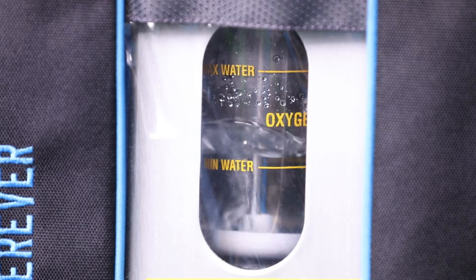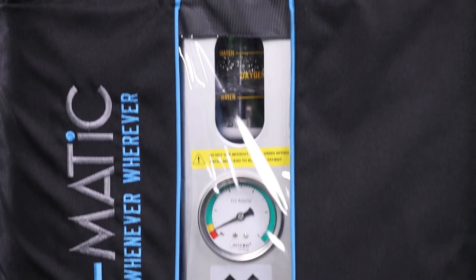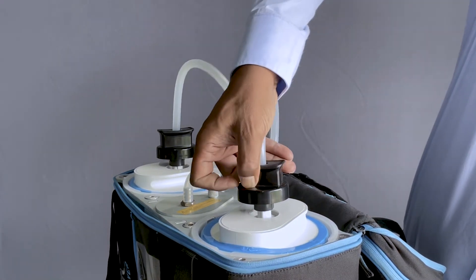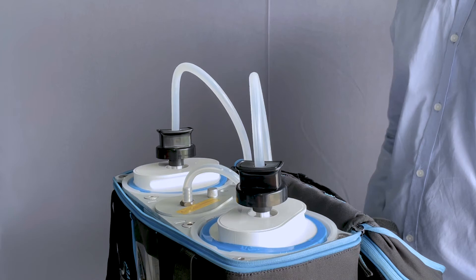Observe the humidifier closely and the pressure gauge. When the bubbling rate goes down and the needle on the gauge touches red, trigger the second cartridge using the second twist trigger. Follow the same steps deployed for triggering the first cartridge.